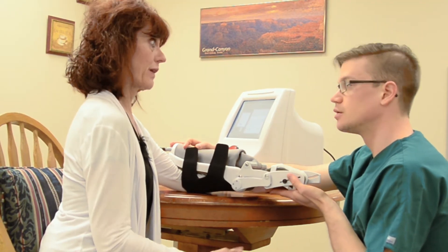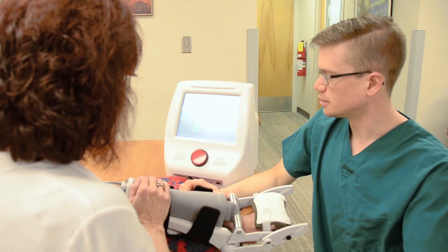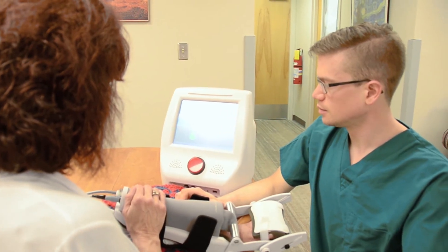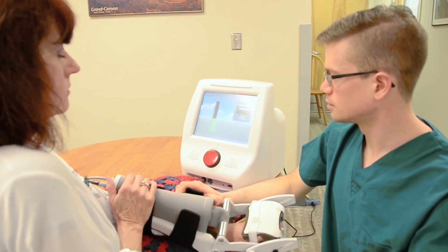One of the major benefits to the HandMentor is that it was designed with home use in mind, so you can complete exercises right in your own home with a flexible schedule that fits your lifestyle. I like having it at home because anytime that I want to use it, it's there — and the real benefit is the repetition. The more you use it, the more you're going to benefit.